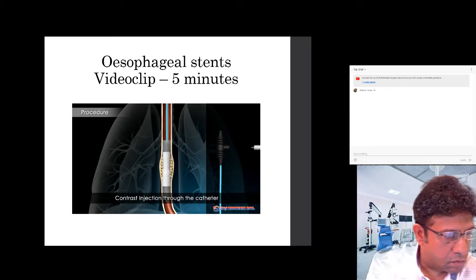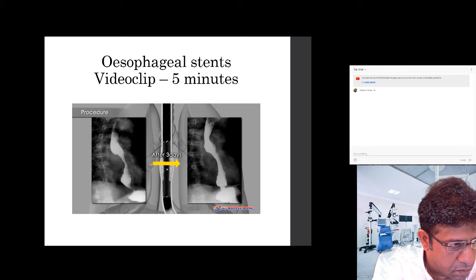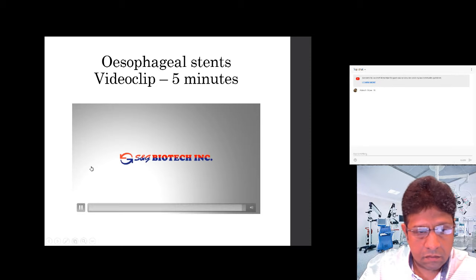If the degree of stent expansion needs to be assessed more accurately, this can be done by further injection of contrast or endoscopically. However, care needs to be taken not to displace the stent by advancing the endoscope through it. Nitinol stents reach their full radial force only after warming to body temperature and will continue to expand for several days. Balloon dilation should be avoided. Your local S&G Biotech representative will be more than happy to answer any questions.